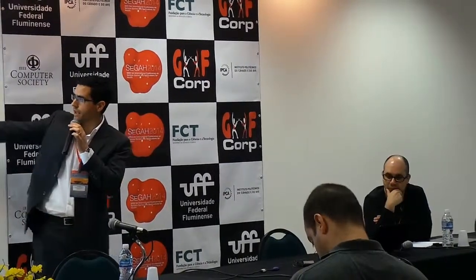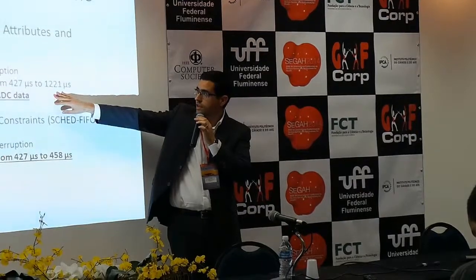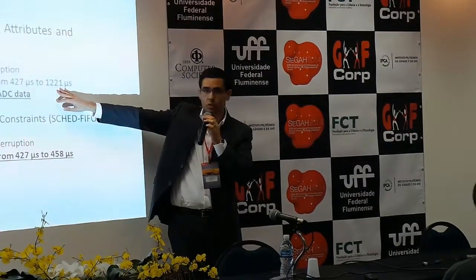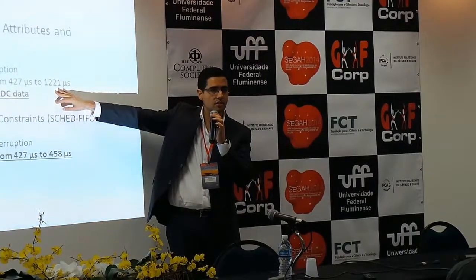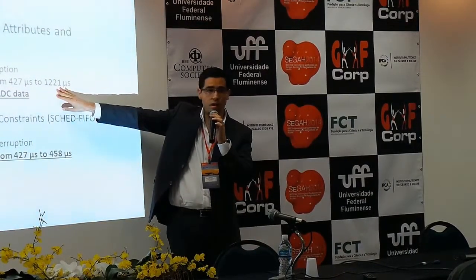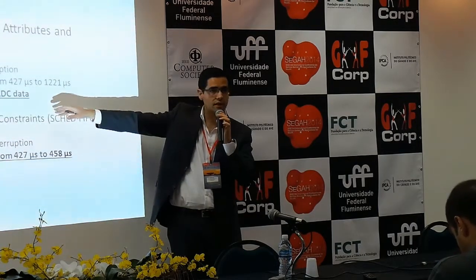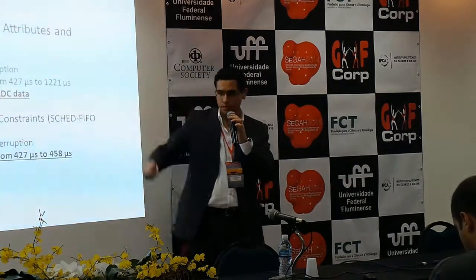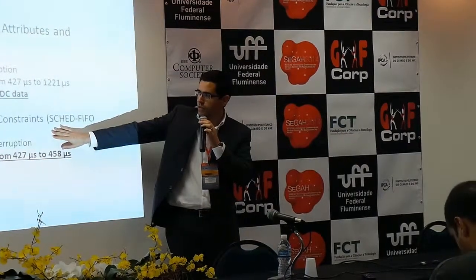Usually on a Linux kernel driver, you have the scheduling attributes and priorities, which are defined by default, and by that we got from 427 to 1221 microseconds to accomplish all the tasks of this platform, which is higher than what we need. So it's very unstable, and it's hard to tune these times.